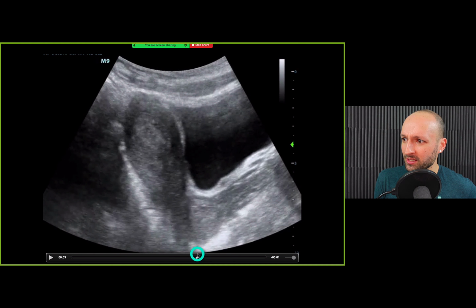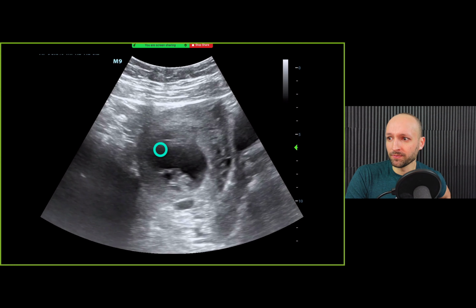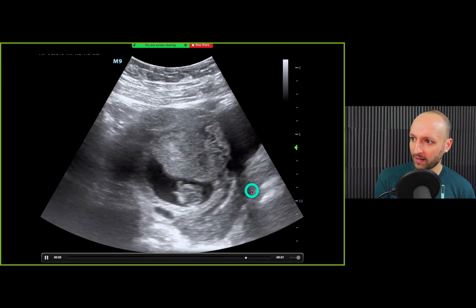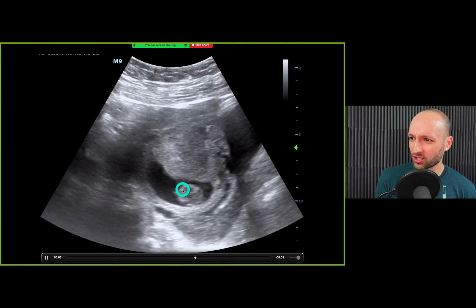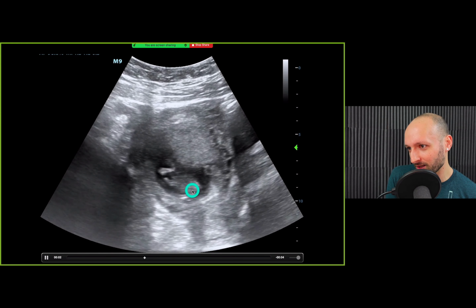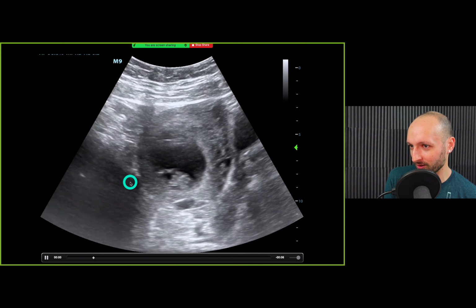Now, this here, this is the vaginal canal. The cervix is right there. And you have to make sure that you're seeing that in line with all of this. And that means that it is, in fact, in the uterus. Here's an example of an IUP, and we can see that right here. We have the vaginal stripe going right into the uterus, and then we can see a nice gestational sac right there. And just for a bit of trivia, this is actually my now 2-year-old's first ultrasound that we did. So that's Logan sitting right there in that little uterus.